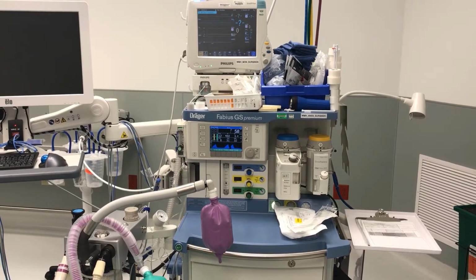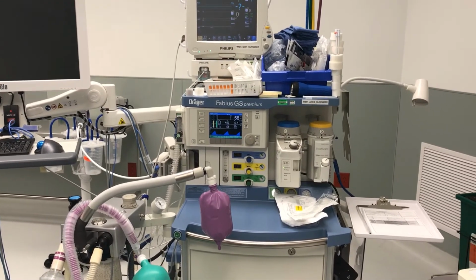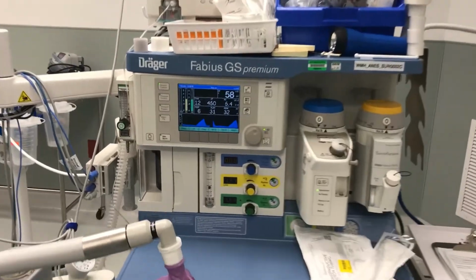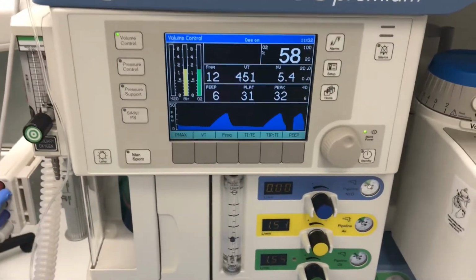So we are now at Memorial Hospital, and I'm going to walk you through the Draeger Fabius anesthesia machine and mostly highlight the differences from the machines at Hedrick Medical Center. As we zoom in, we have the monitor window.